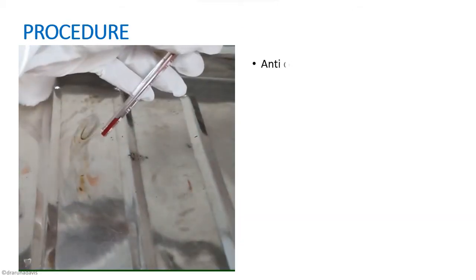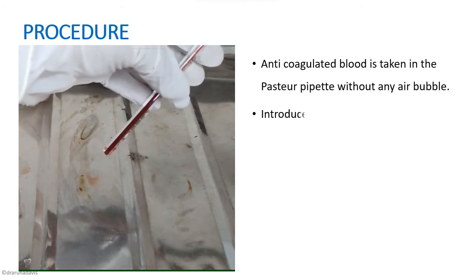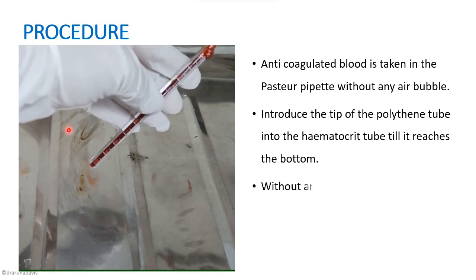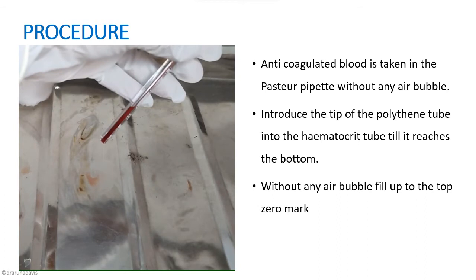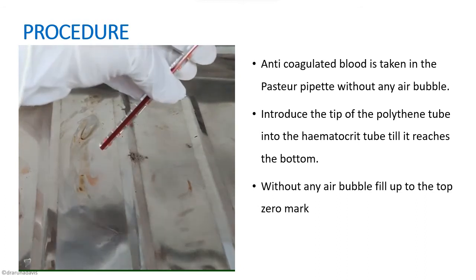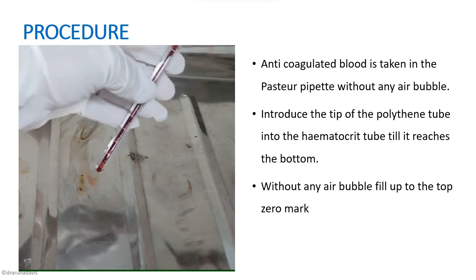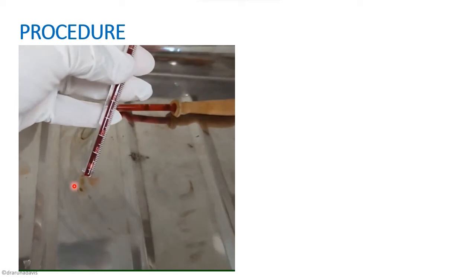To do this experiment, we first take anticoagulated blood in the Pasteur pipette without any air bubbles. We then introduce the tip of the polythene tube into the hematocrit tube until it reaches the bottom, and slowly fill the tube without any air bubbles up to the zero mark present on the tube.